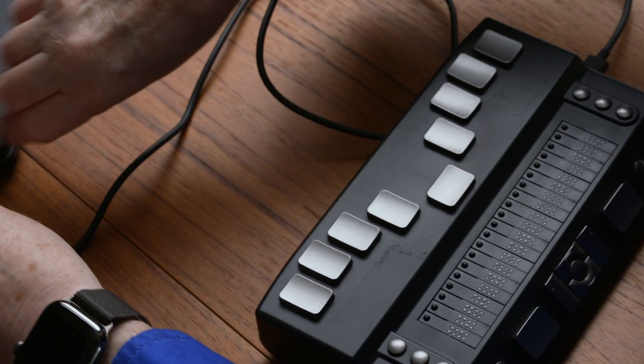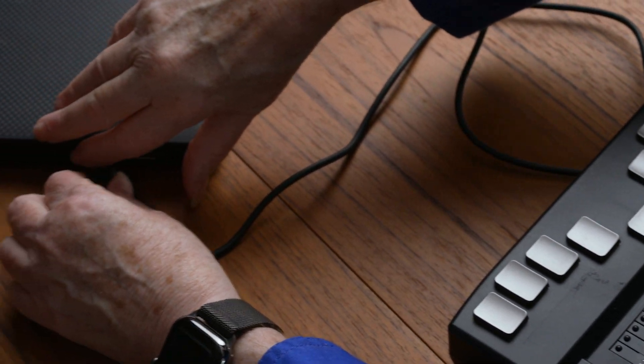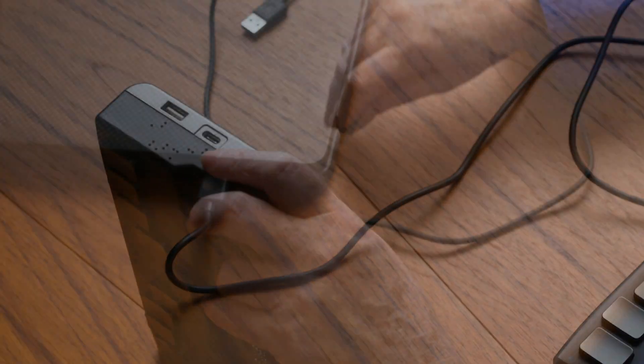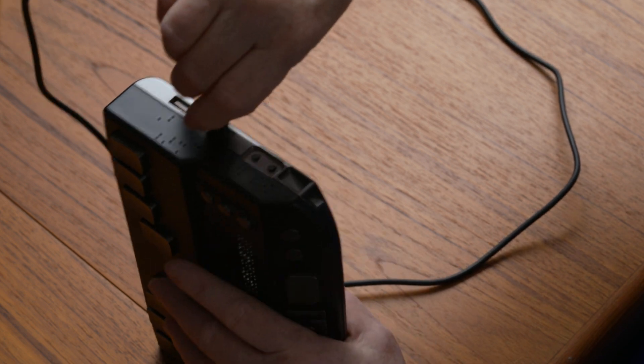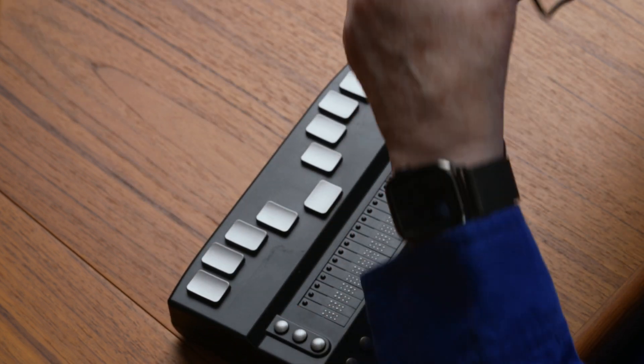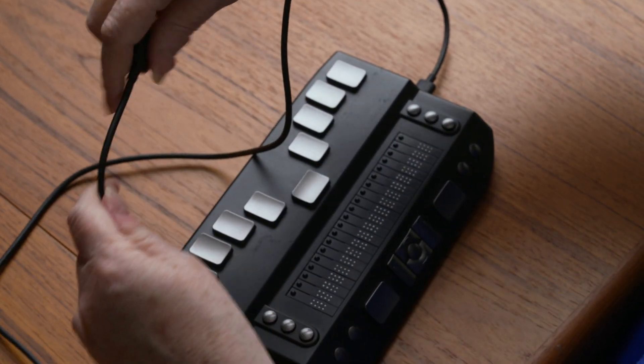Connect the eReader to the computer using the included USB cable. On the eReader end, you will be using the USB-C port, the smaller one, at the center of the unit on the right side. On the computer end, use any available USB port.